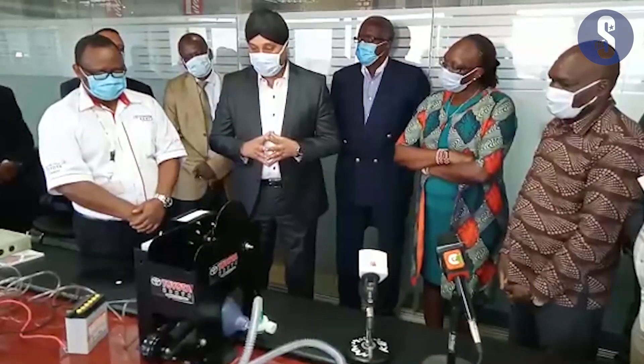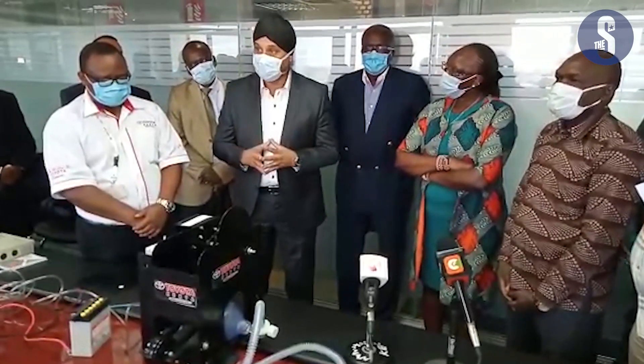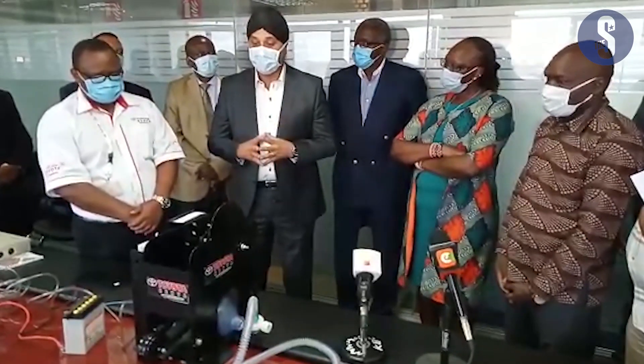In terms of cost, how much it actually costs to produce this — it will be less than a hundred thousand shillings to actually produce this.